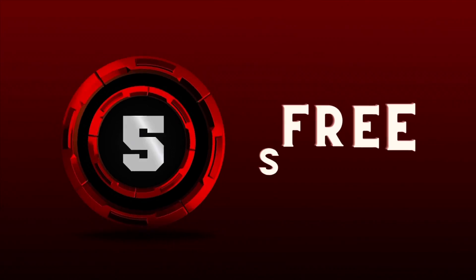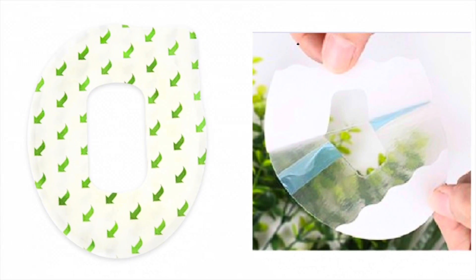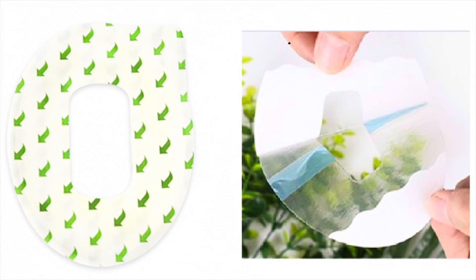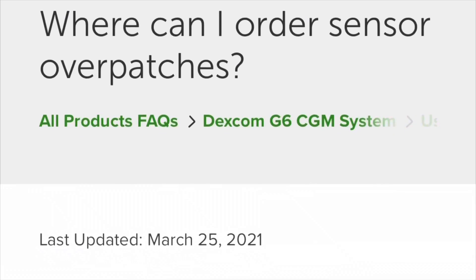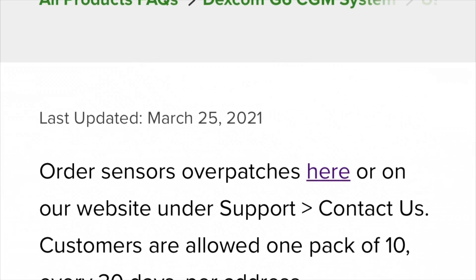Number five: free stuff. This is something Dexcom definitely doesn't advertise, but Dexcom will give you free sensor over-patches if you just ask nicely. The sensor over-patches are these little clear plastic adhesives that go over the outside of the sensor — keeps it nice and clean, keeps it from falling off. And why they don't automatically include these in the box, I don't know. But if you want them, you can order them from their website or even straight from the app, 100% free, no shipping costs.